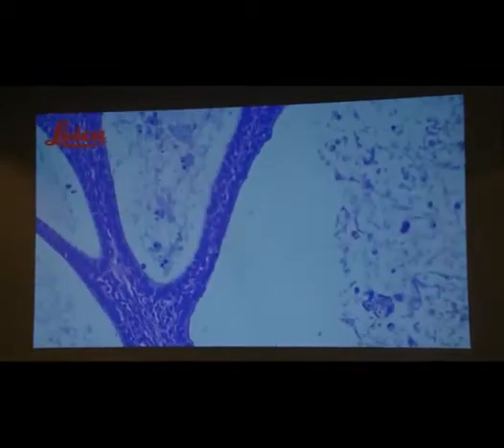It's again a bilateral mass, and whenever you have this kind of case in which you can easily detect mitotic figures and apoptotic bodies, you have to think of the cervix as well. I'm not saying that all of them come from the cervix, but you have to think of the cervix. And in this case, this was a metastasis, and I'm going to show you the primary tumor in the cervix.